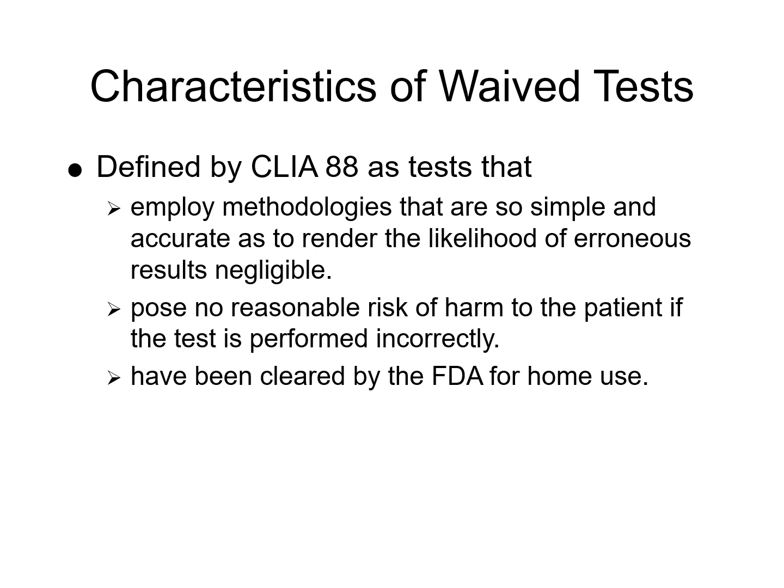It's going to have FDA clearance, so they have been cleared by the FDA for home use. Some implications, so it can be performed by minimally trained personnel or patients themselves at home. This typically includes rapid assays, test strips, or home kits. But they must still follow manufacturer instructions and quality procedures to maintain reliability.